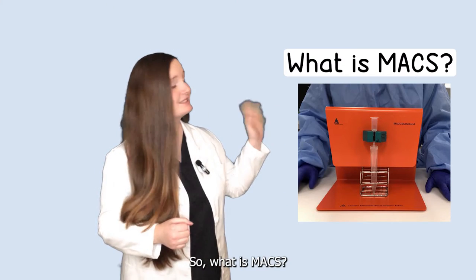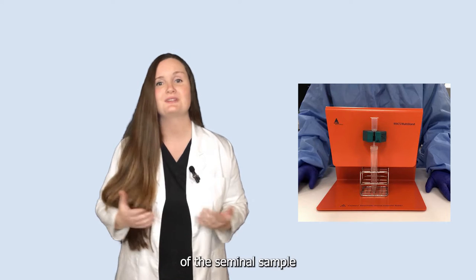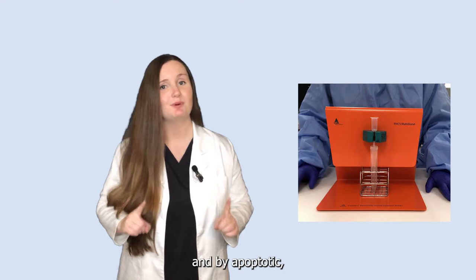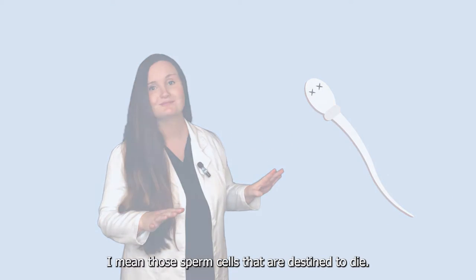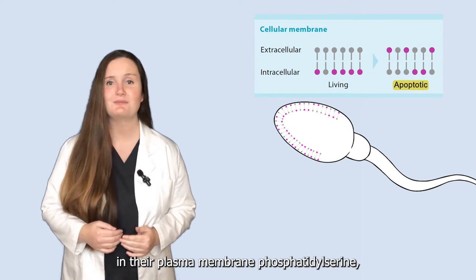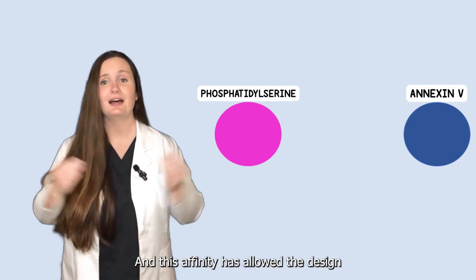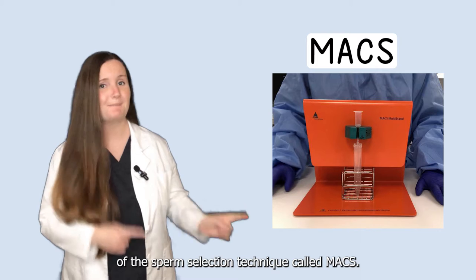So, what is MACS? MACS is a sperm selection technique that can be used to improve the overall quality of the seminal sample by removing the apoptotic sperm cells — and by apoptotic I mean those sperm cells that are destined to die. Apoptotic sperm cells externalize plasma membrane phosphatidylserine, which has high affinity for Annexin-5, and this affinity has allowed the design of the sperm selection technique called MACS.